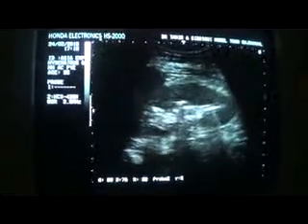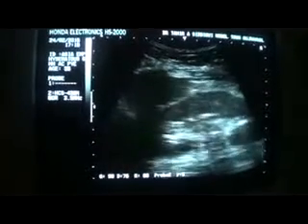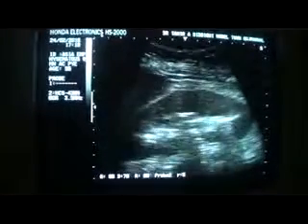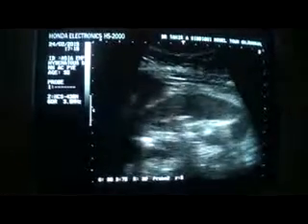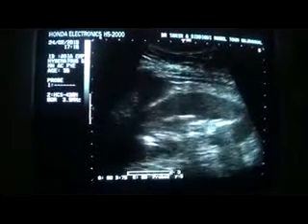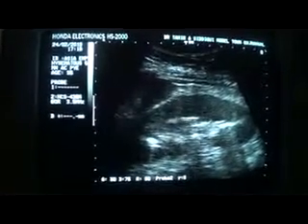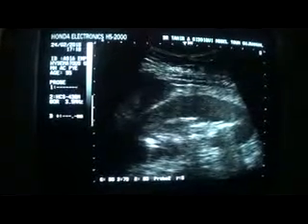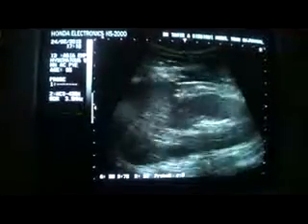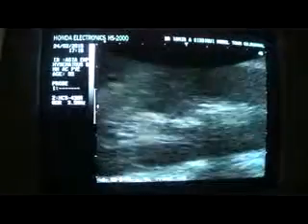I am going to magnify for you so that a better understanding can be developed. You see, they are in all the calyceal system from the upper to the lower pole. None of the areas is spared. All these multiple echogenic areas, dirty shadow, few giving comet-tail artifact, few giving sharp shadow, so all types. So this finding is very much consistent with.